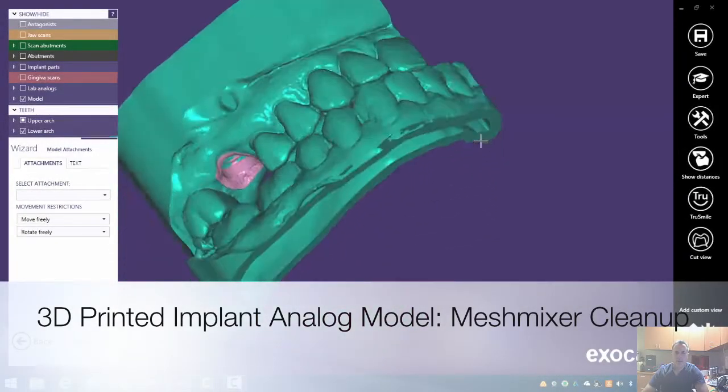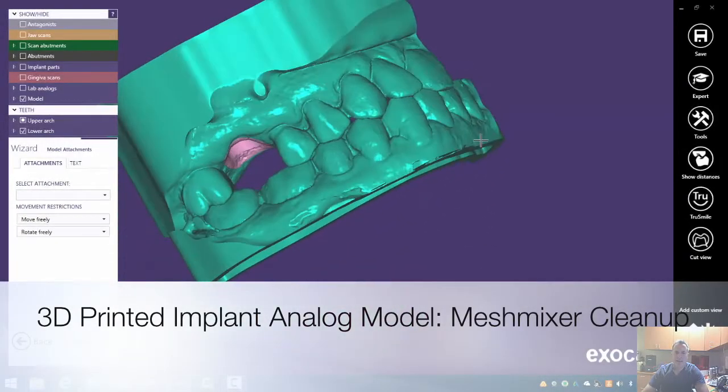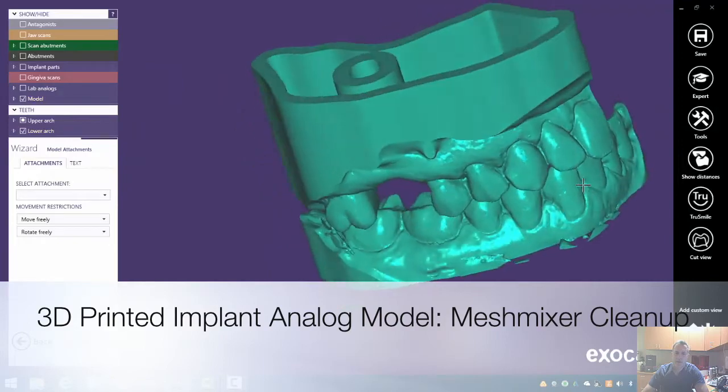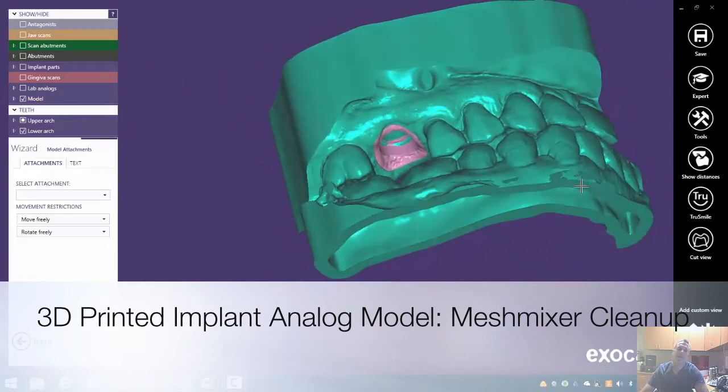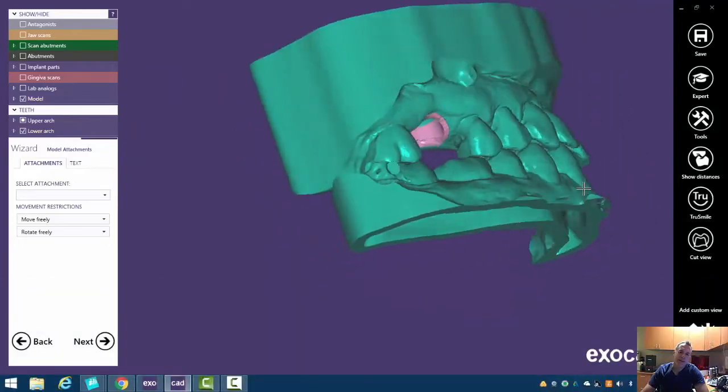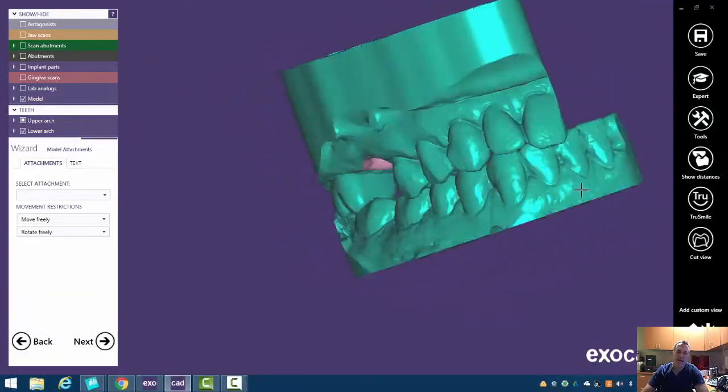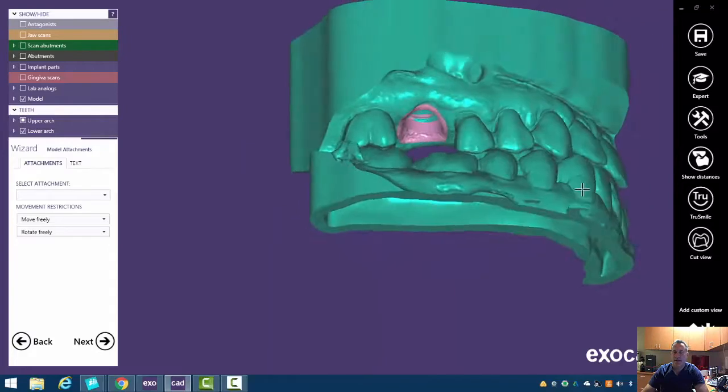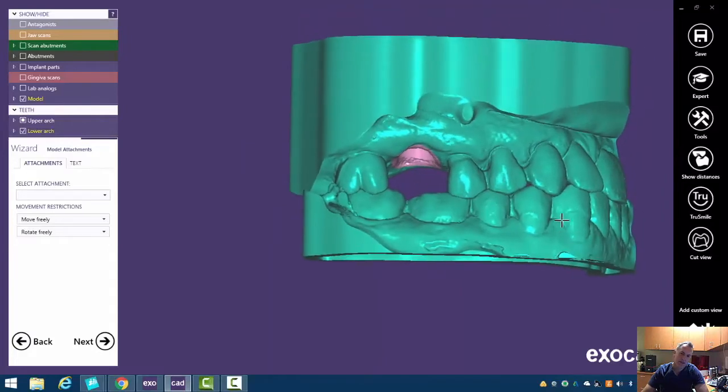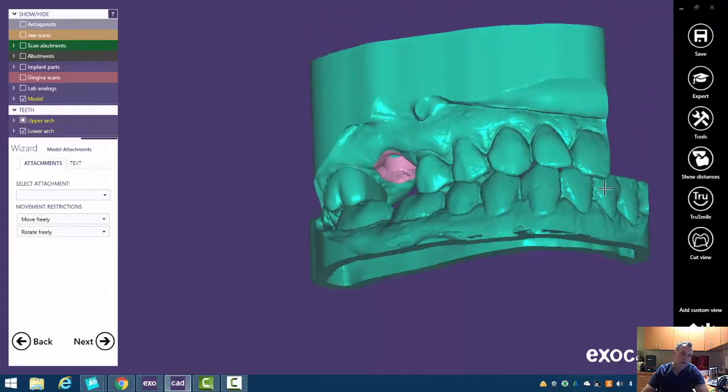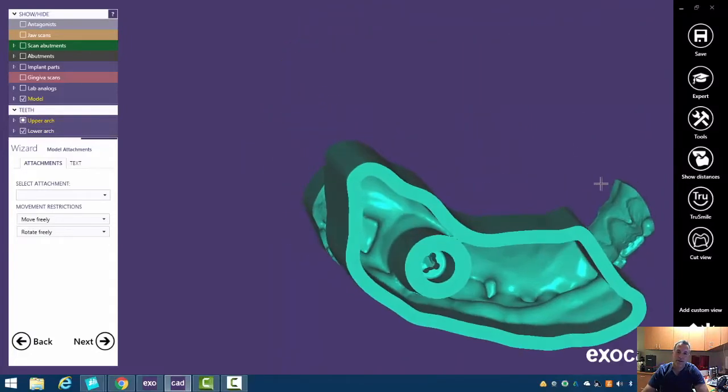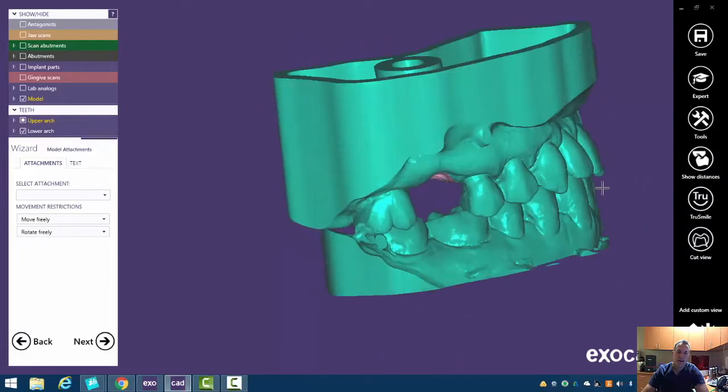In this last video we're going to go over model attachments. So one thing that's cool about 3D printed models is we can articulate them and there's lots of different disposable articulators or fully adjustable articulators you can do if you want to.